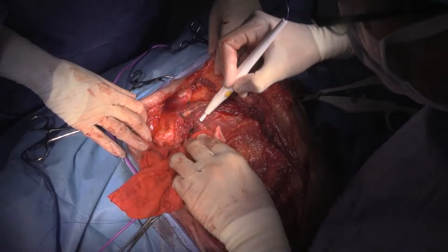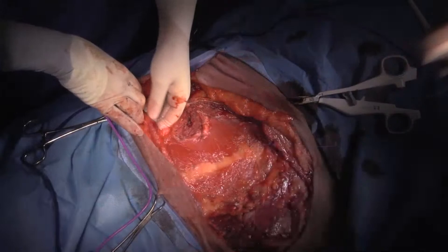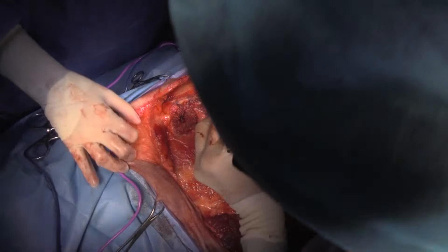So when we go to close this, we're going to close the trapezius here to the rhomboidus and latissimus dorsi caudally.